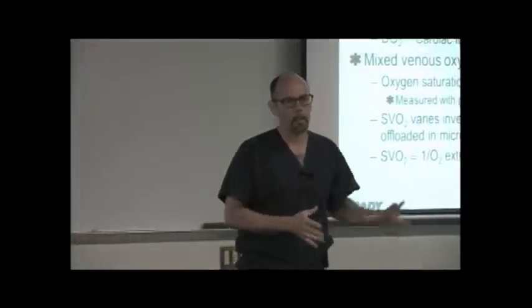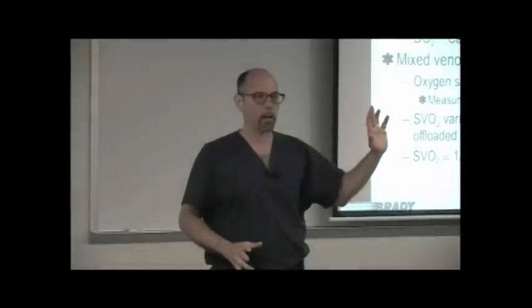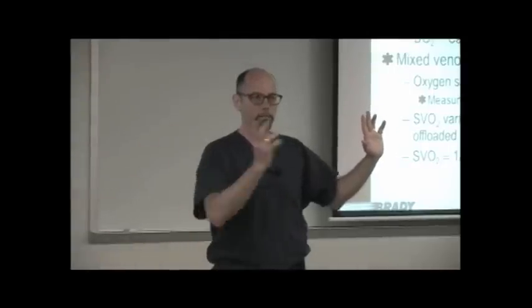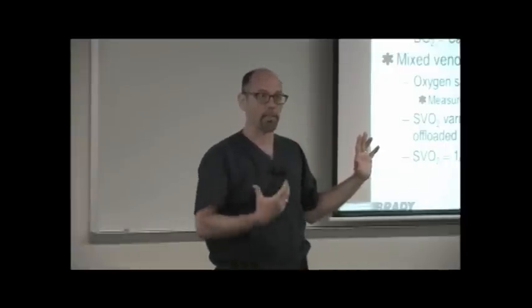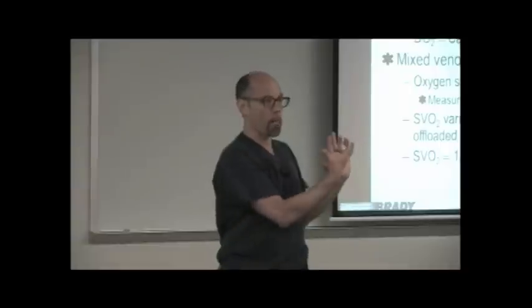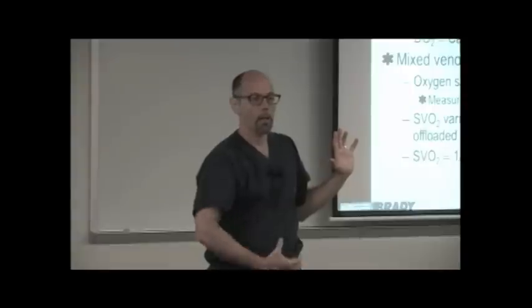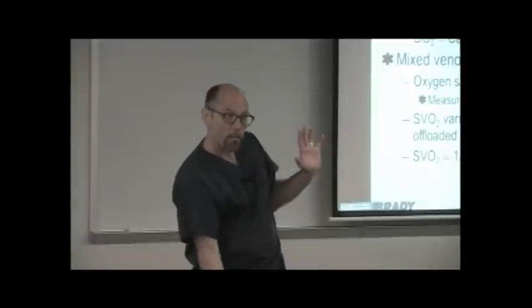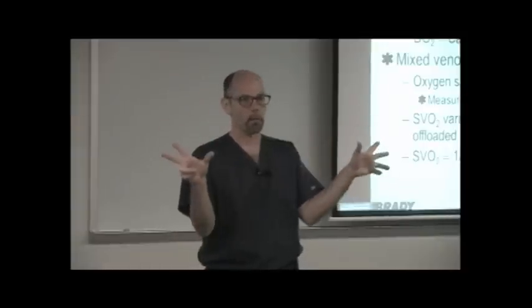So now, let's take this one step further. Got a patient with pneumonia who now has septic shock and cardiac failure. Their saturation is 80% arterially on their pulse ox. They're in a high metabolic state because of their sepsis. Their heart's not working, so I'm not pumping those hemoglobin molecules around very well. So the ones that are present in the peripheral circulation have a longer time to give up their oxygen.